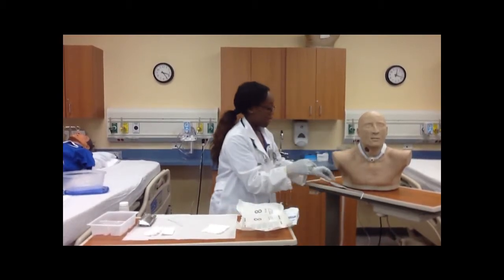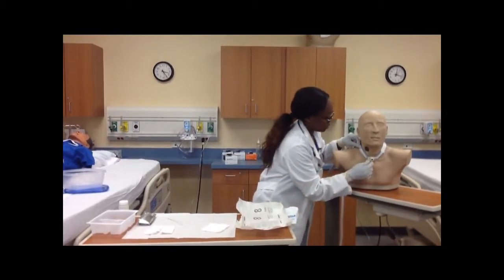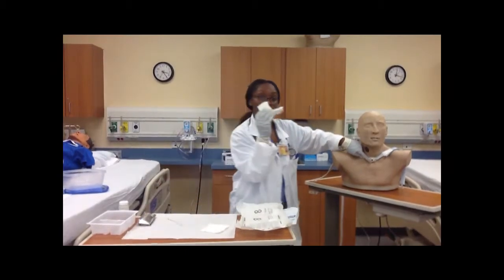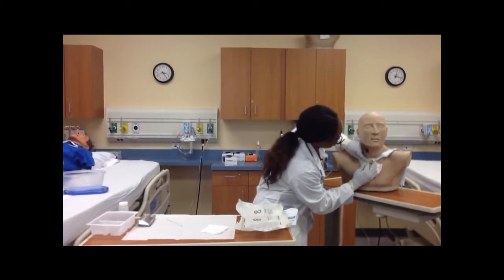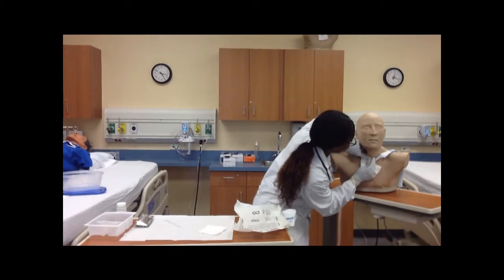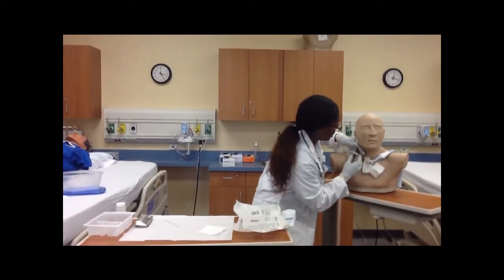Now, I have my Velcro necktie that I have to place in there. What I do is I remove one portion, holding on, making sure that it doesn't come off. And at the same time, I have my second gauze to replace it. I can cuff the gauze underneath it, making sure not to pull out the trach or pull hard on it. You wouldn't want to cause any trauma. And also make sure your pilot valve is hanging outside and not underneath it.